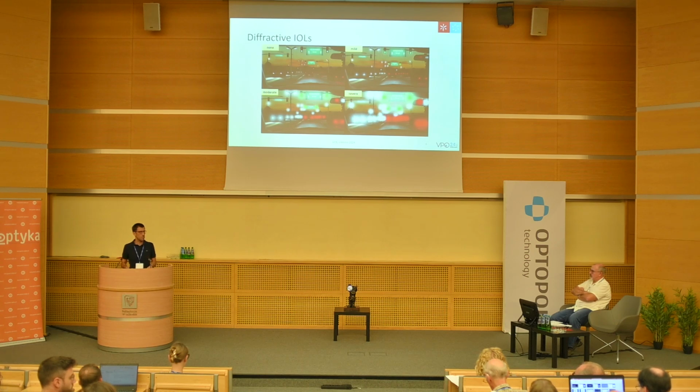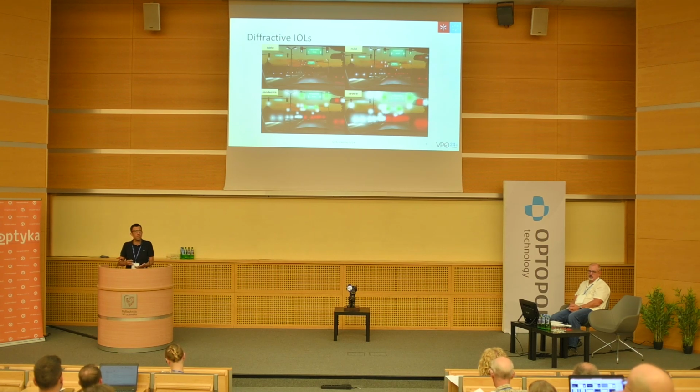One of the issues that still needs to be improved in these devices is how you can reduce these side effects to the limits of physics. When you're talking about multifocal systems like this, you're talking about simultaneous vision systems. So there is a part of these symptoms that you cannot eliminate, because you always have a part of the light that goes through the pupil that is out of focus. Imagine you have a bifocal lens and you are looking at distance: a part of the light is focused elsewhere and is going to be out of focus. That part you cannot get rid of. It's intrinsic to this type of design.